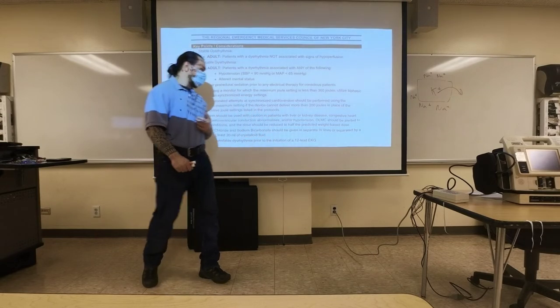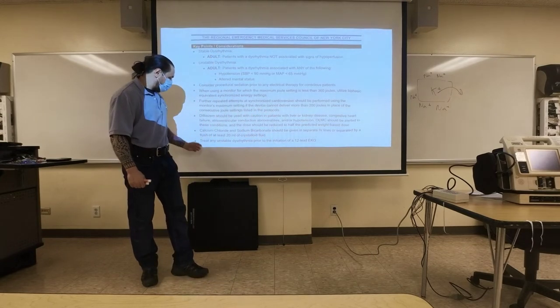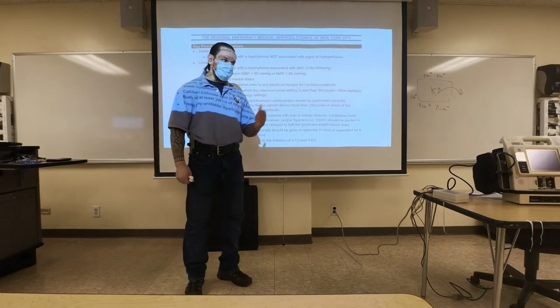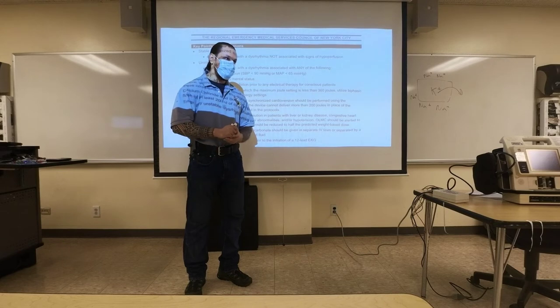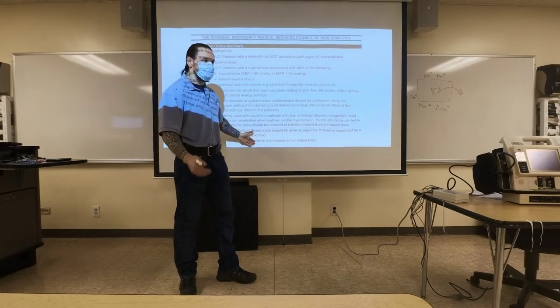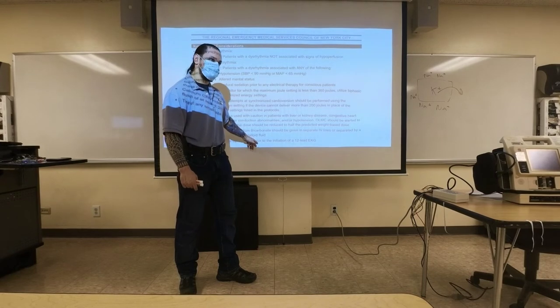However, I'll say that is not a good thing that they added, right? Treat any unstable dysrhythmia prior to initiation of 12-lead. I know of a particular case where a person had a third-degree heart block, right? The medics said we have to treat the underlying rhythm before we can do a 12-lead. Make sense? Third degree, the person was altered mental status and conscious. They started to pace. They never did a 12-lead.